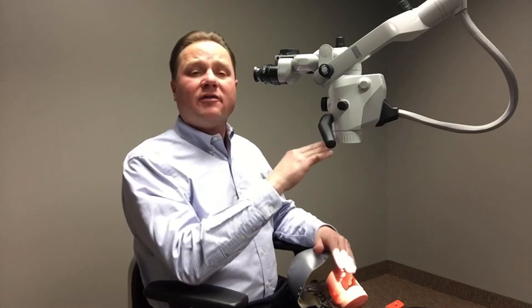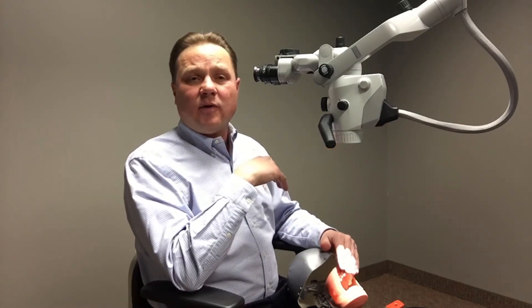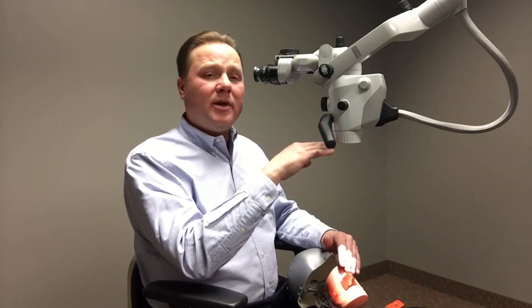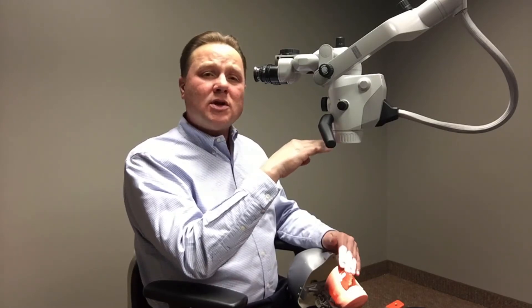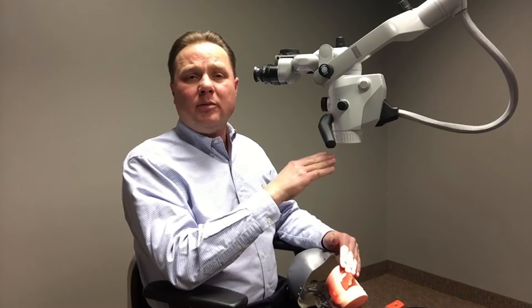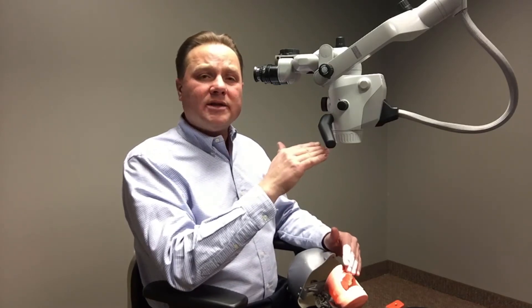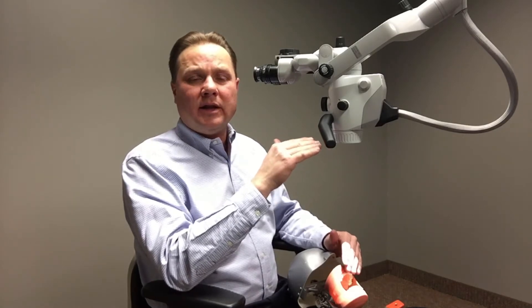The first is our VariaScope product. VariaScope is the fine focus adjustment that will provide the operator the ability to remain in focus anywhere from 200 millimeters all the way to 430 millimeters of working distance. And that working distance is the largest range of any product in the industry, period.